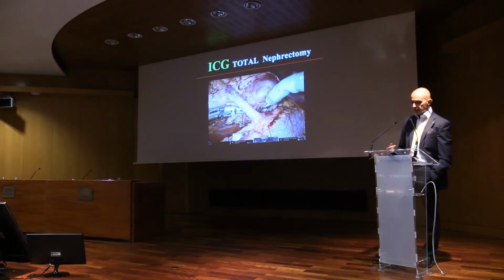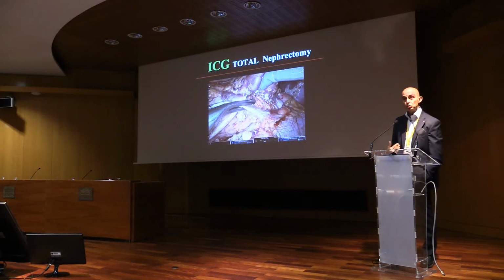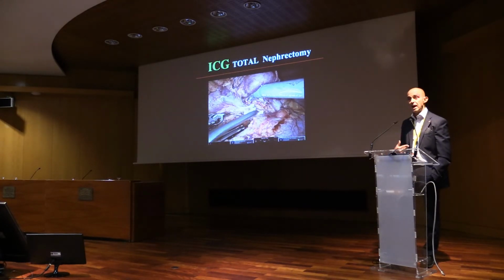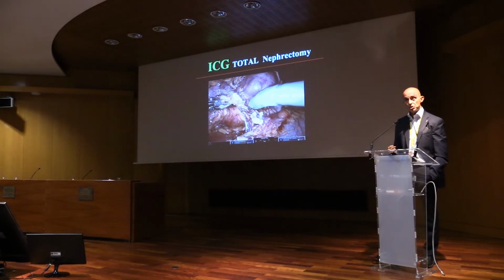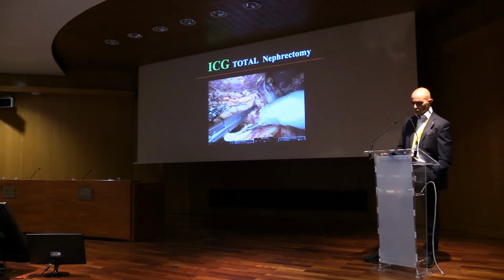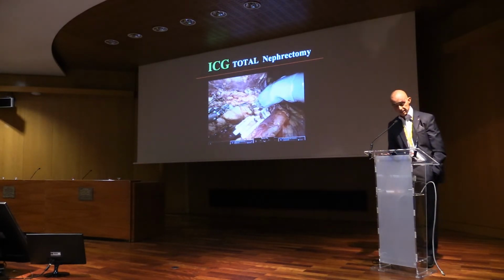Next. Usually we perform nephrectomy in laparoscopy, but for tumors we prefer robotics, as in this case, and robotics has the system called Firefly, an integrated ICG, and you can use ICG. If you have Da Vinci Xi robots, in robotics we prefer to use Hem-o-lok to secure the vessels. For this reason, also in robotics, you already have this technology integrated in the system.